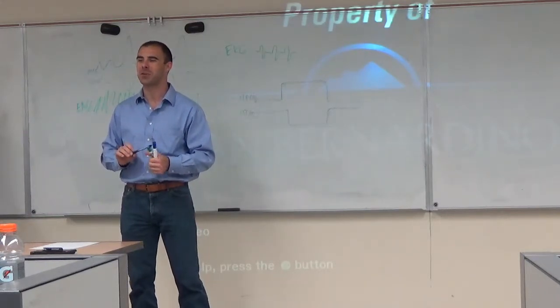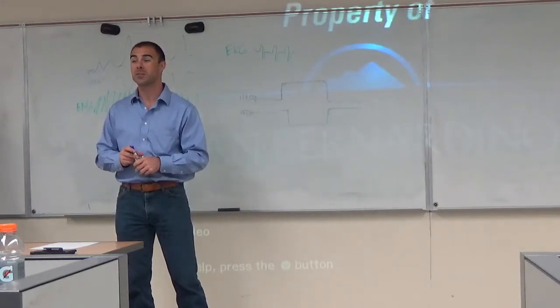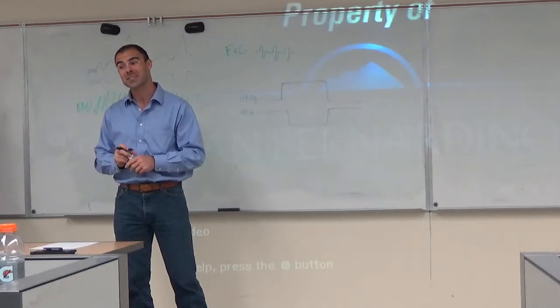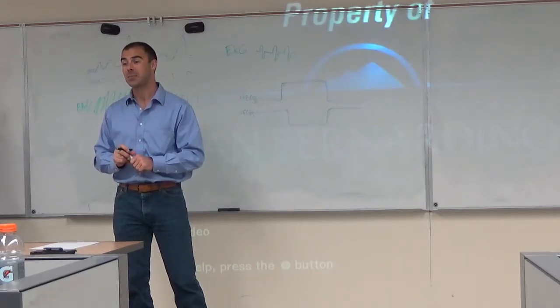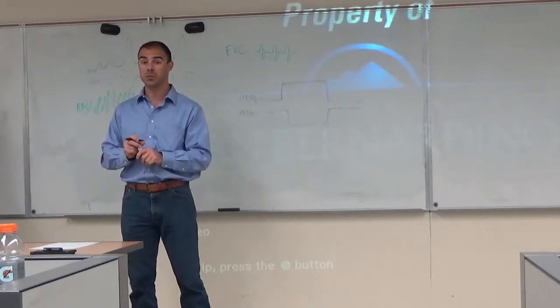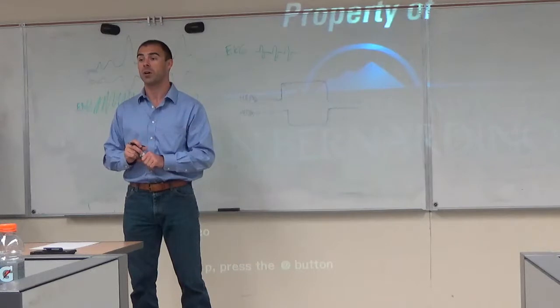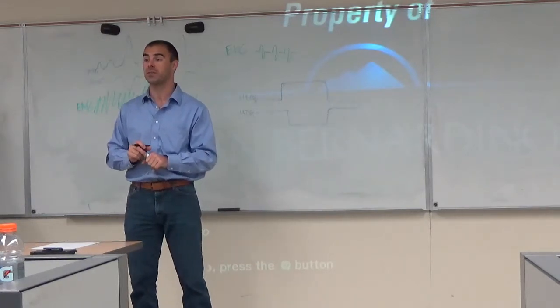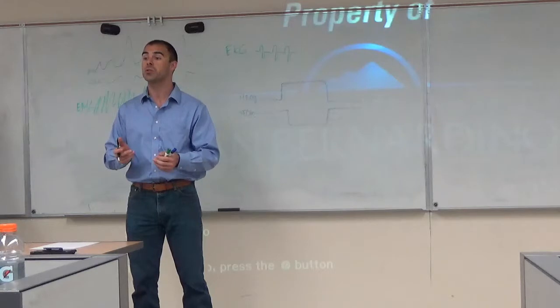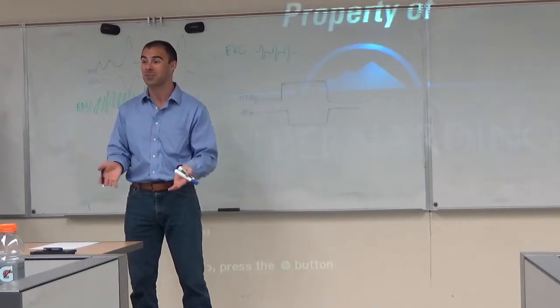So some people consider it an artifact if it's not really what they're looking for, because a lot of times it might reflect when you're about to go to sleep, very drowsy and things like that. Other times you might actually have hypotheses about alpha. Particularly, let's say that you study attention. Maybe you want to study ADHD in people. Alpha turns out to be a frequency of activity that is very closely related and correlated with states of attention. And so in that case, you wouldn't call it an artifact. That's actually your variable of interest.